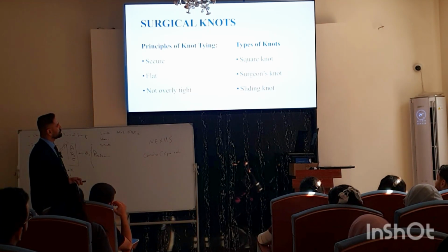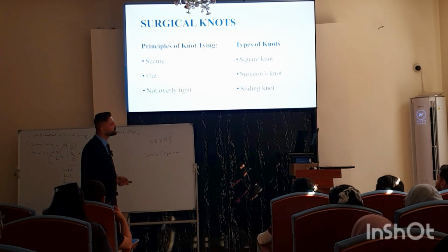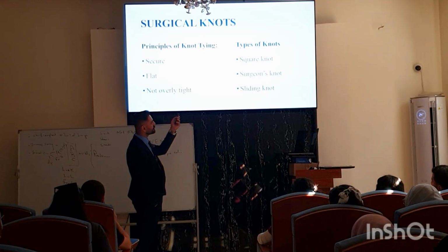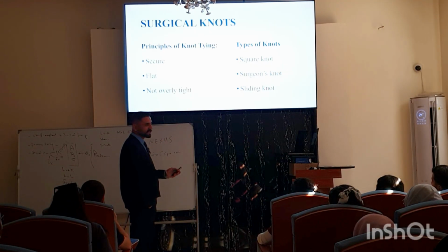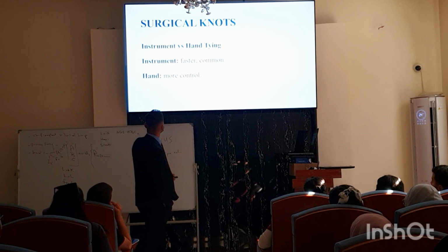Surgical knots, the principle of tying: it should be secure, as flat as possible, not overly tightened. And the types are square knot, surgeon's knot, and sliding knot. These are the common ones. The difference, I don't know if I have a slide about this.